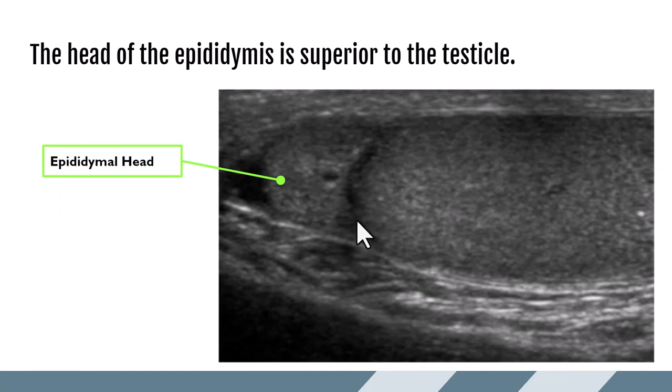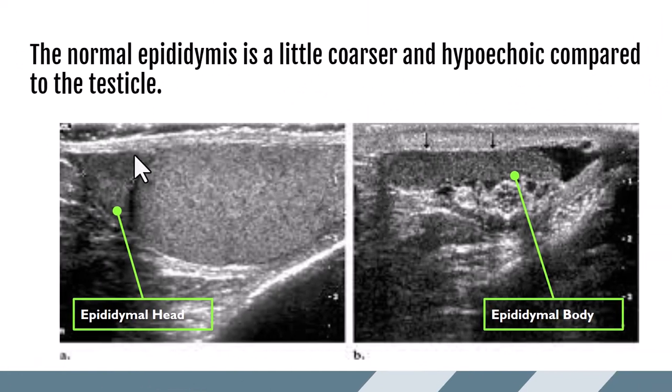On ultrasound, the head of the epididymis is seen superior to the testicle. In the longitudinal plane, shifting up toward the head, we see it sitting like a little hat on top of the testicle, taking on a more triangular shape. It appears isoechoic to slightly hypoechoic compared to the testicle and usually has a coarser echo texture. Here we can see the epididymal head sitting on top — just ever so slightly hypoechoic compared to the testicular parenchyma — and an elongated body of the epididymis with clearly different coarseness and echogenicity compared to the testicle itself.